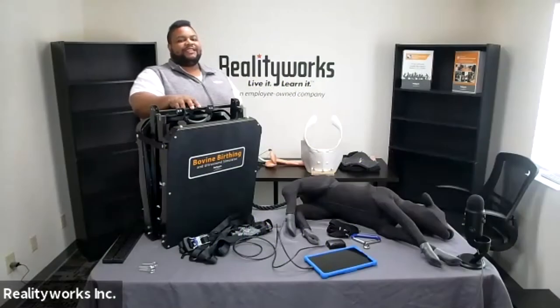Hello, my name is Nathan Danielson. I'm a product support specialist here at RealityWorks, and today I'm going to spend a little time with you talking about our bovine birthing and ultrasound simulator.